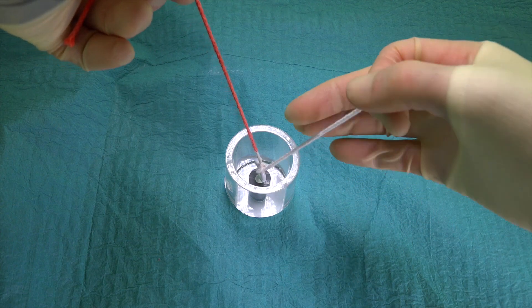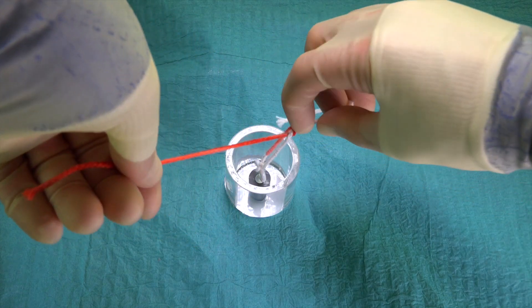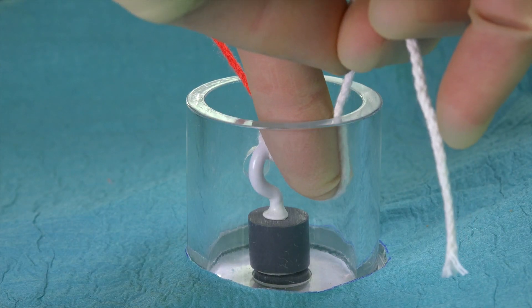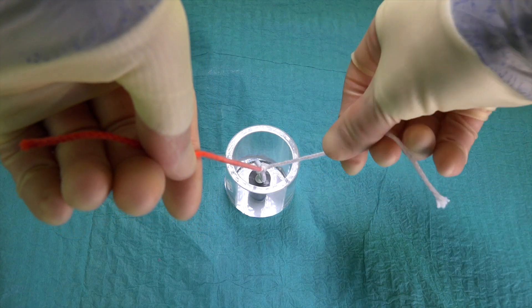The second and third throws of the knot are performed with the same hand movements as we would for any reef knot. And as each of the throws has been snugged down with the right index finger, the left hand maintains gentle upward tension to prevent the knot from loosening.